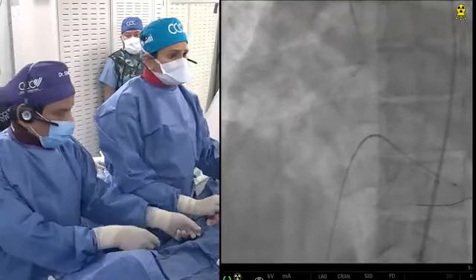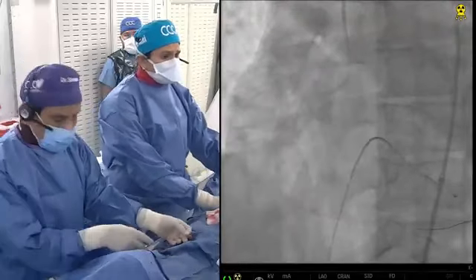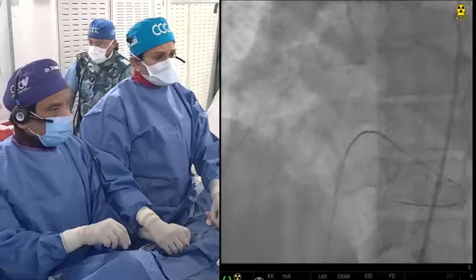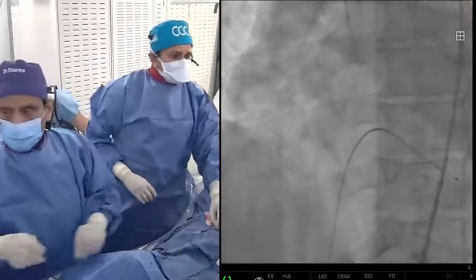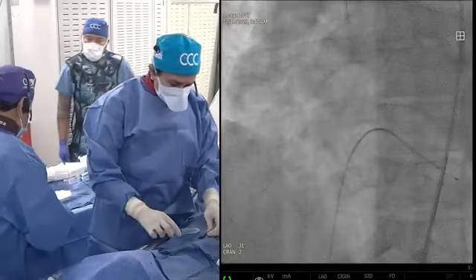Okay, you can take a picture. No, take this one out. You don't want this one. This will be occluding. I don't think so. Let's change it to rota and then, yeah. Want to go with rota extra support? Okay, extra support wire. Rota extra support. You can't just talk like that.